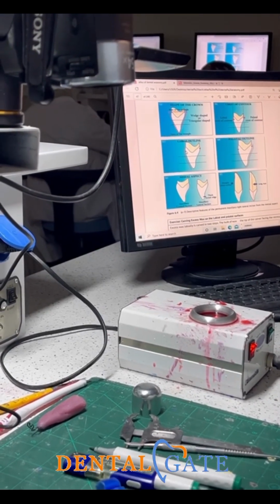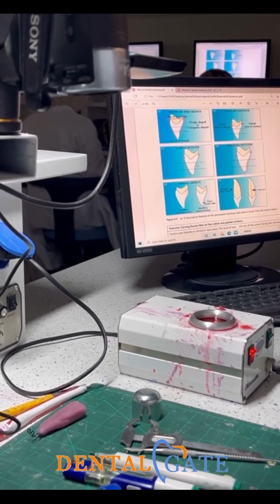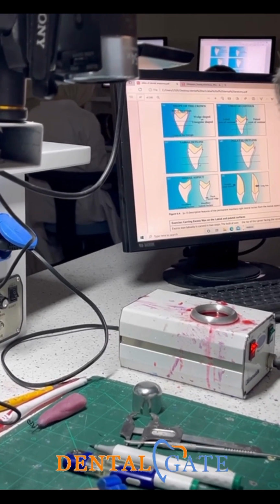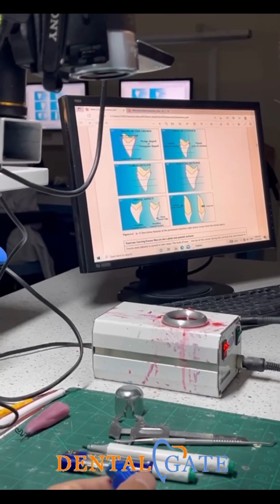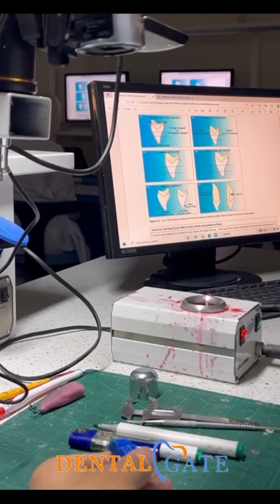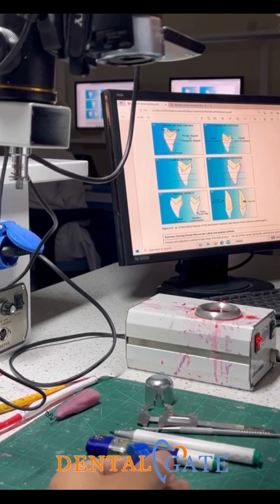So this is for what? This is for the whole crown. Please pay attention. This is for the whole crown because I don't have any measurement here. There is no measurement here. I will depend it upon the shape. So I will start with the measurement of the whole crown. You can add another one at the cervical. So we have 4 measurements, but unfortunately all of them in the cervical third.